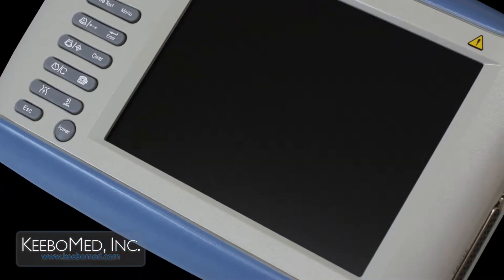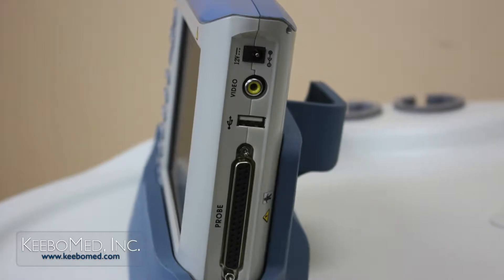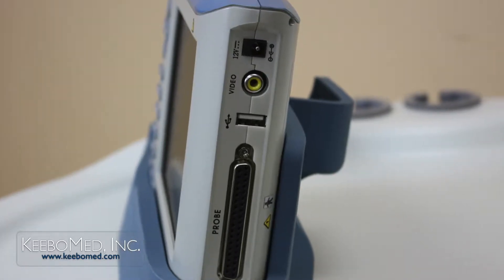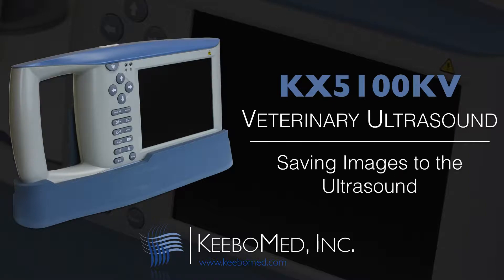Saving, deleting, and importing images to a USB drive can be easily and quickly performed on the KX5100KV. Follow these steps to save an image to the ultrasound system.